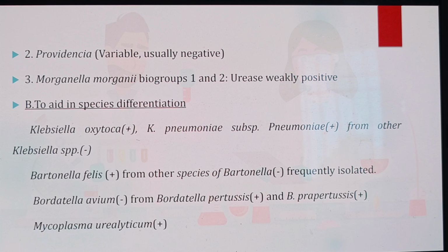Bartonella felis shows positive reaction and is distinguished from other species of Bartonella which show negative reactions. Bordetella avium is negative, but Bordetella pertussis and parapertussis show positive urease reactions. Next, Mycoplasma urealyticum is the only Mycoplasma strain which shows positive urease test.